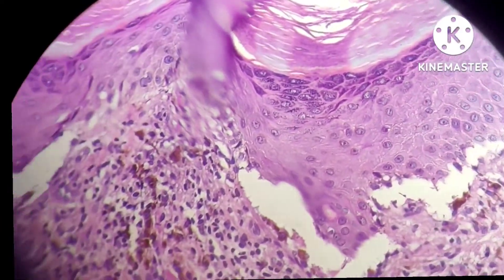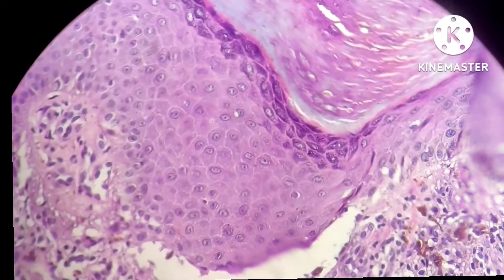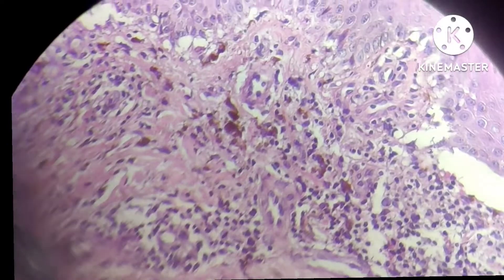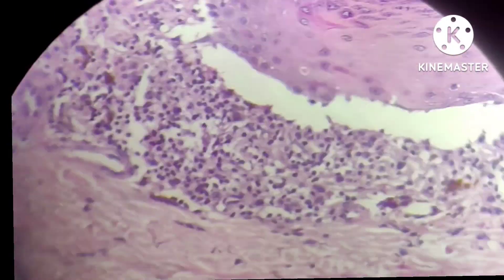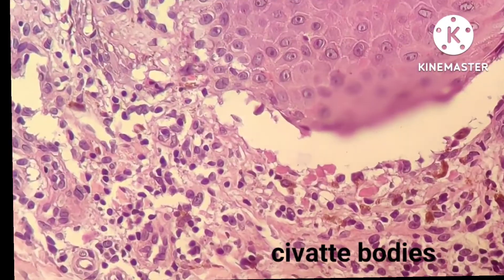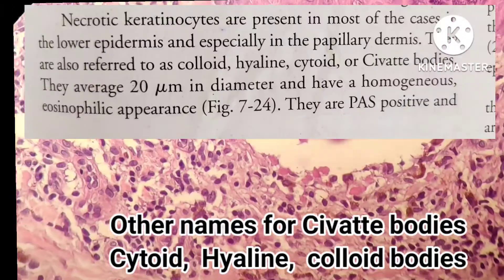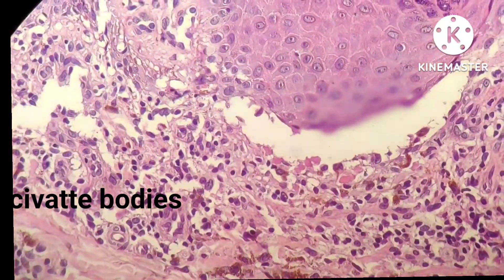There is compact hyperkeratosis. Look at the hypergranulosis, which is uneven and appears wedge-shaped. These granular cells are large and have quite coarse keratohyaline granules. The next feature to observe is civatte bodies, which are necrotic keratinocytes — about 20 microns in size, present in the lower epidermis or papillary dermis. They are eosinophilic homogenous bodies which are PAS positive.